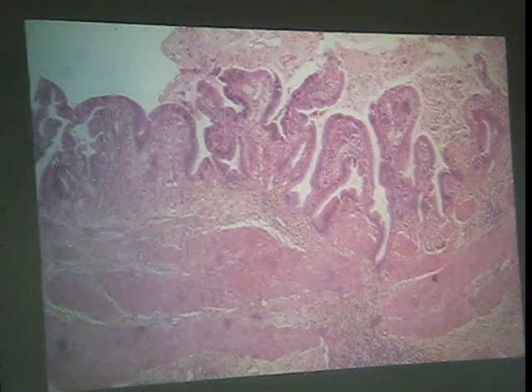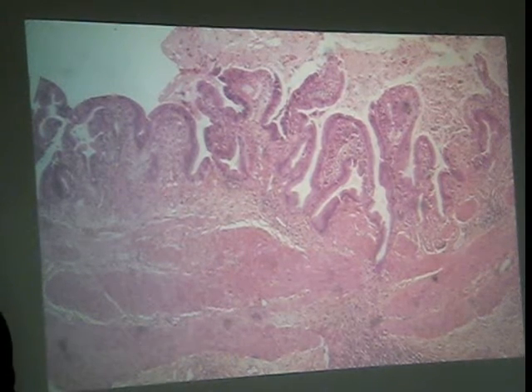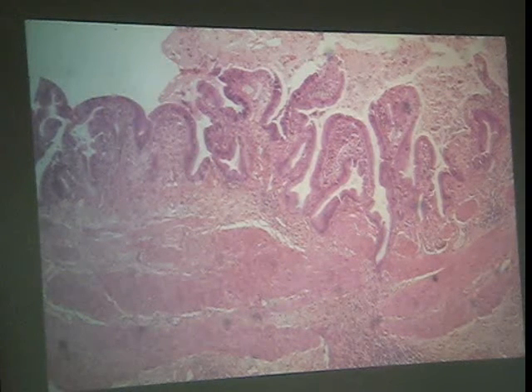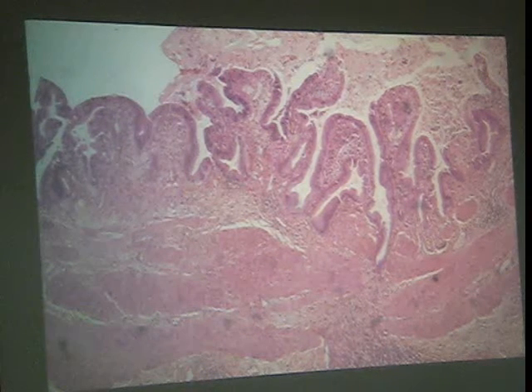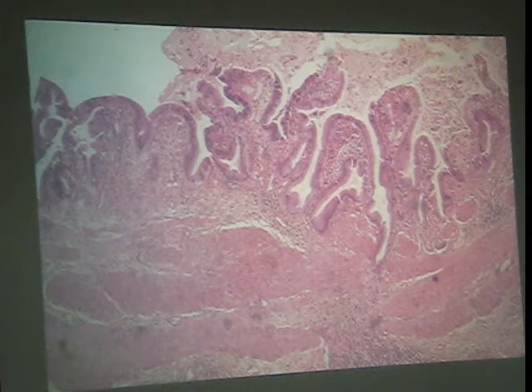Yeah, gallbladder, how do you know? It's kind of one of those funky by exclusion, but still, go for it, Rebecca. How do you know? It's a really weird way of knowing. I remember it because, no, that's cool. Have you ever seen the movie The Little Mermaid? Yeah, I have. In Ursula's cave, she turns the mermaids into these little squiggly things. All right, I'll accept that.